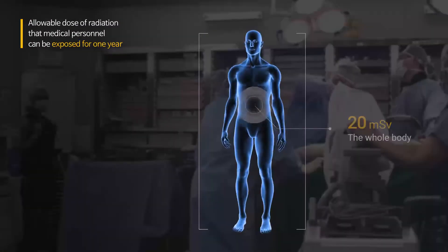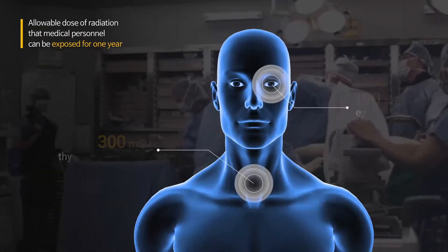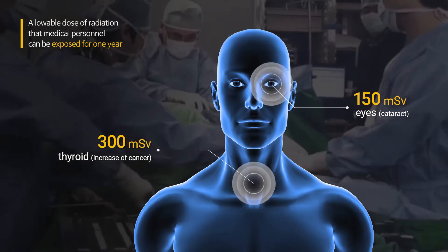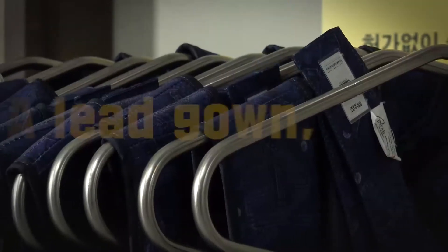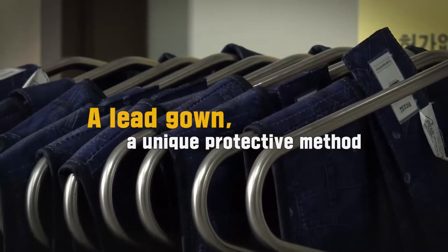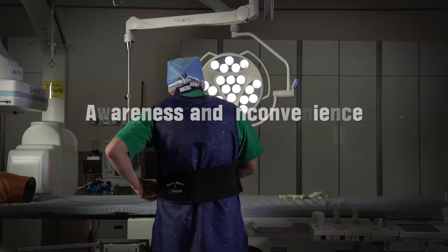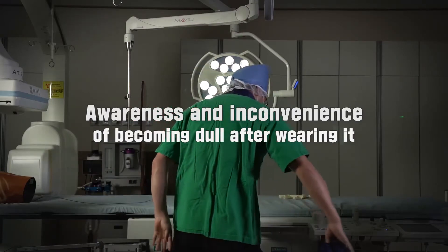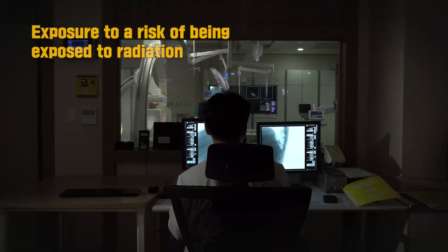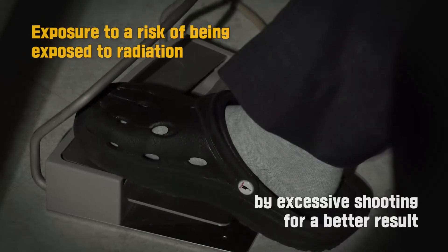The allowable amount of radiation that medical personnel can be exposed to for one year is set up by the International Commission on Radiological Protection. However, a considerable number of doctors are exposed to the inconvenience of a shielding tool to block radiation and a risk due to excessive shooting for a better result during procedures.